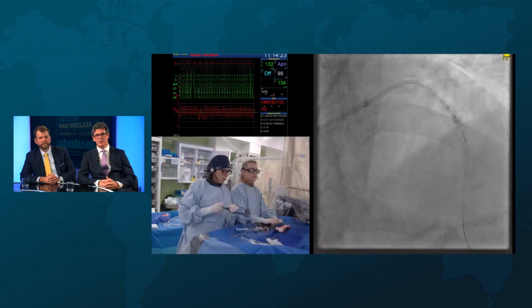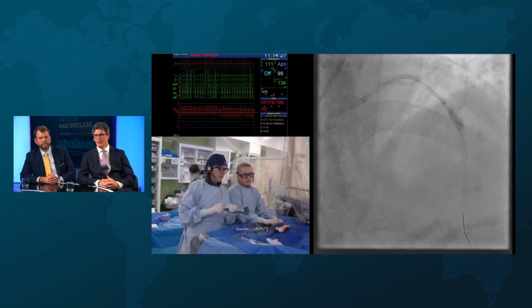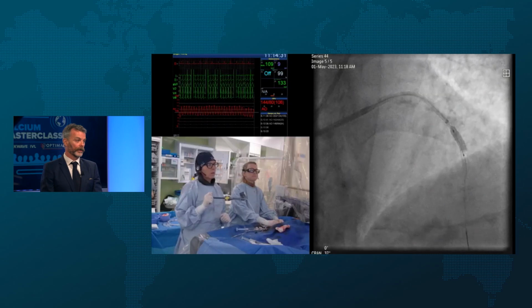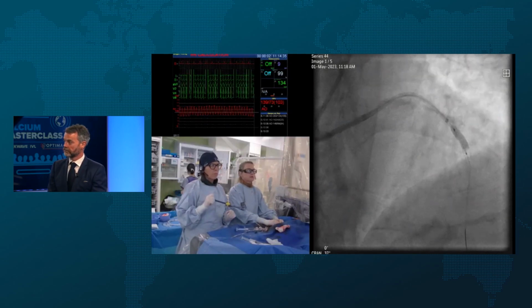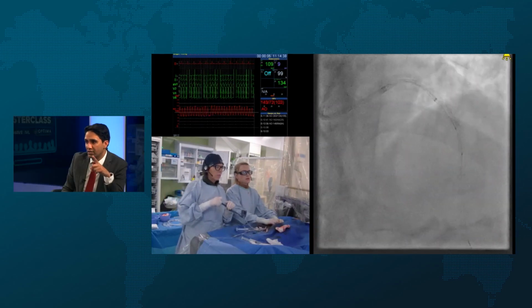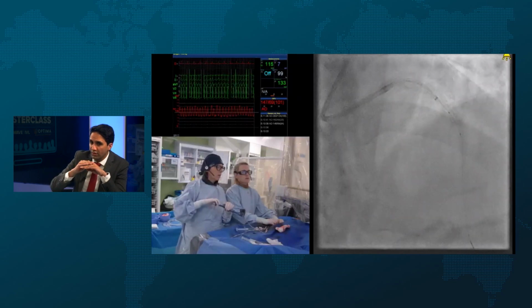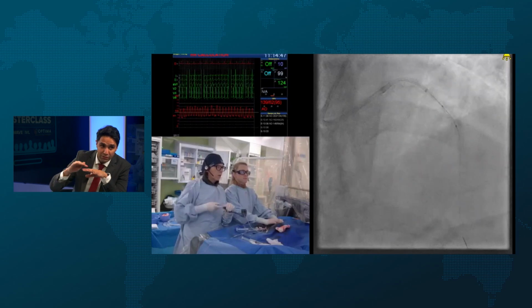It's lovely delivery. But it's very difficult to understand the exact length in the absence of co-registration, which is a big weakness in the Boston IVUS at the moment. That's coming though, I hope. Yeah, it's coming. This is an important point when you're doing long segments of IVUS. Remember the artery slides over the IVUS catheter, so it's like taking 2 steps forward and 2 inches back.